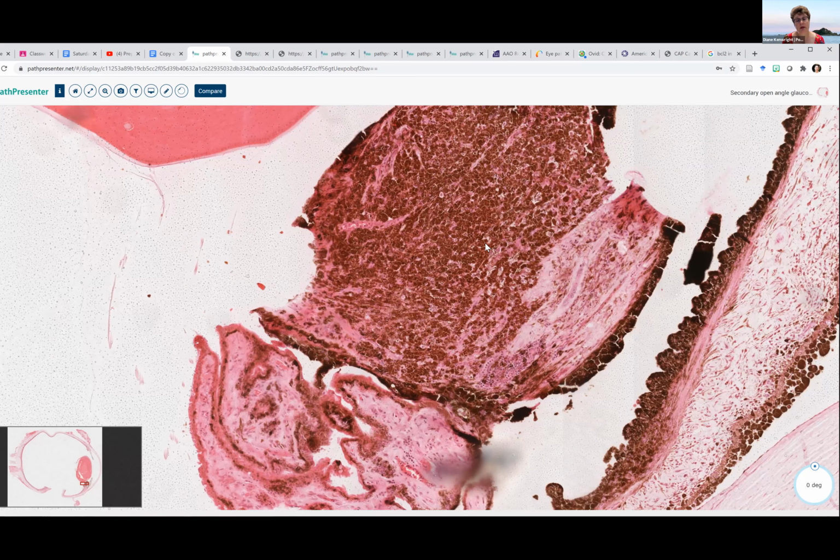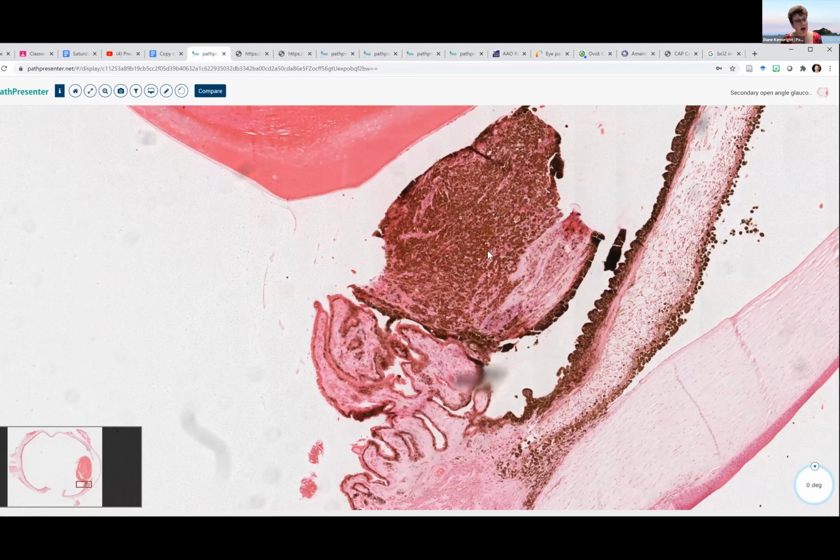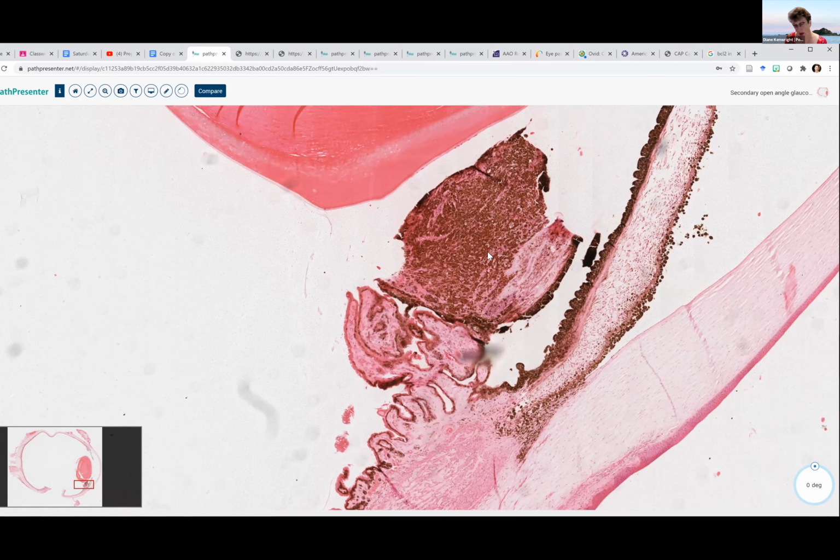Okay, we've got some suggestions here. Iris rub. Yeah, it could be rubbing against the iris. An immune response. We could, though we don't see that. I was thinking of two other things. I was thinking maybe it's undergone some ischemic event. And the other thing is maybe it's had some radiation, post-radiotherapy. So if I saw this, I would definitely go and look for features of radiation in the eye and positively or negatively comment on them.